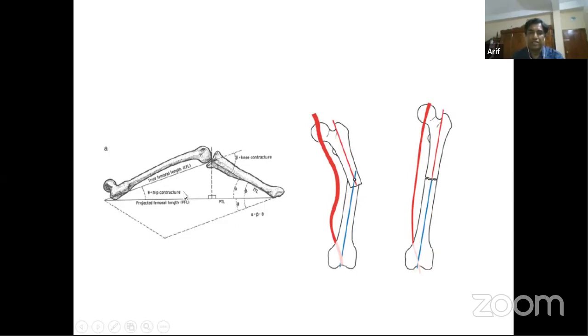I do not want to go into details. How can you calculate the actual length of the tibia, fibula and femur after the correction? Because here is a degree, there is cosine, some trigonometric calculation. I do not want to go into details. I want to give you the idea that if you lengthen this, there will definitely be a gain, and there will be tension of the vessels. Usually the vessels produce a bow, and when you strain the bones, they will produce very much pressure.